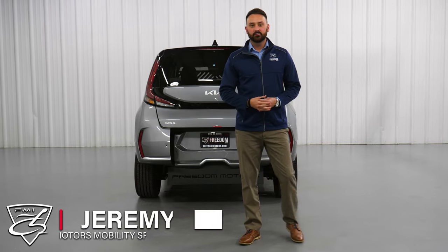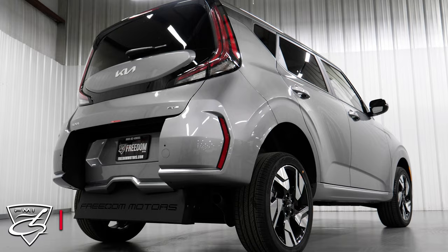Hi, my name is Jeremy Culver. I'm a Mobility Specialist here at Freedom Motors USA. Today we're going to be taking a look at the Kia Soul Wheelchair Accessible Vehicle.